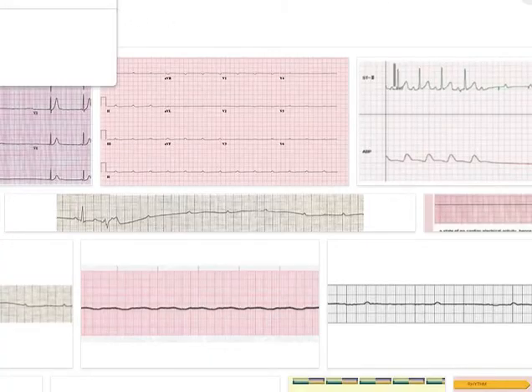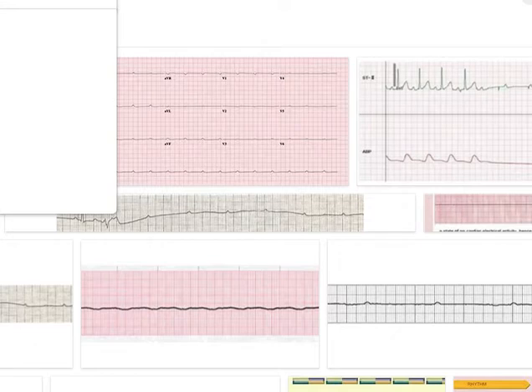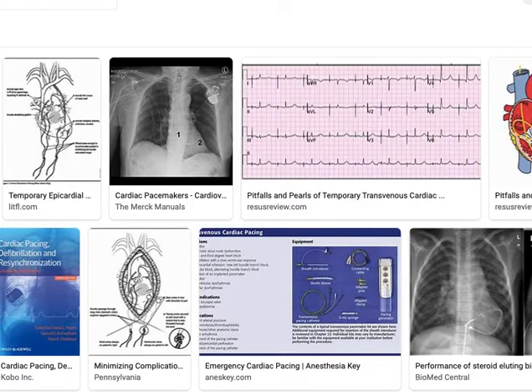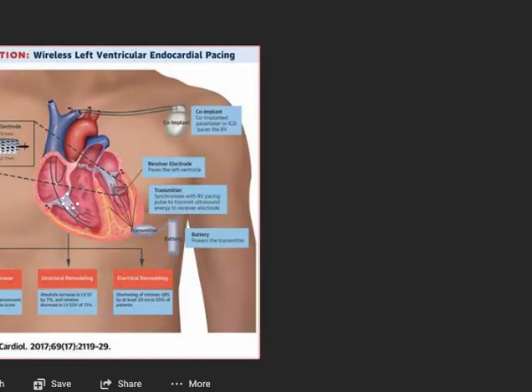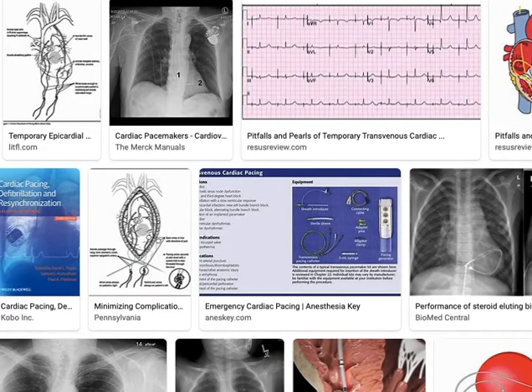What is cardiac pacing, by the way? Of course, we cannot do it in an emergency when the patient is outside any specialized care. Now we are going towards treatment. They put a pacemaker in the chest and put wires in the heart. This keeps delivering current to the heart, and the heart beats.